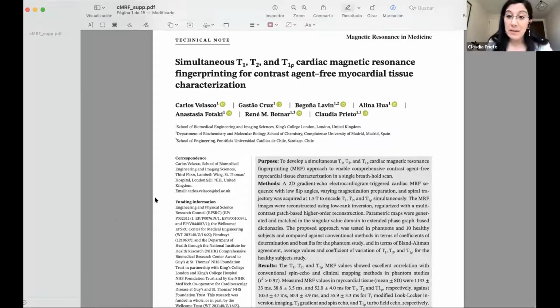So this is actually implemented in Philips. Most of the other cardiac MRF approaches are implemented on Siemens, which, just echoing what Carlos said, means we do need to do multi-vendor and reproducibility studies. We are already collaborating with some groups, actually with the group that is presenting afterwards. So we are very happy to share it.